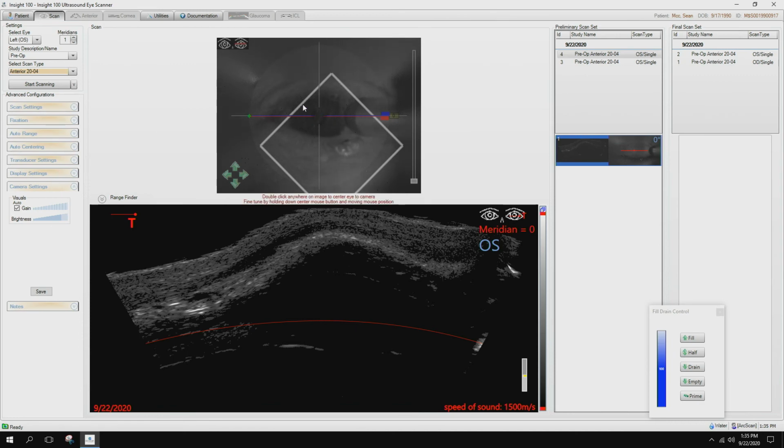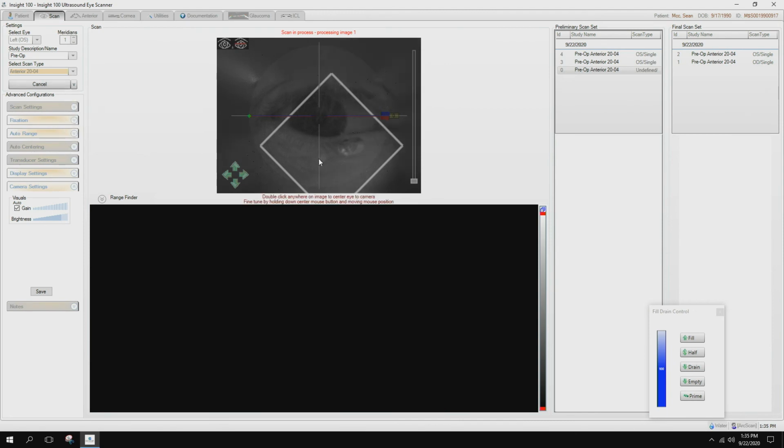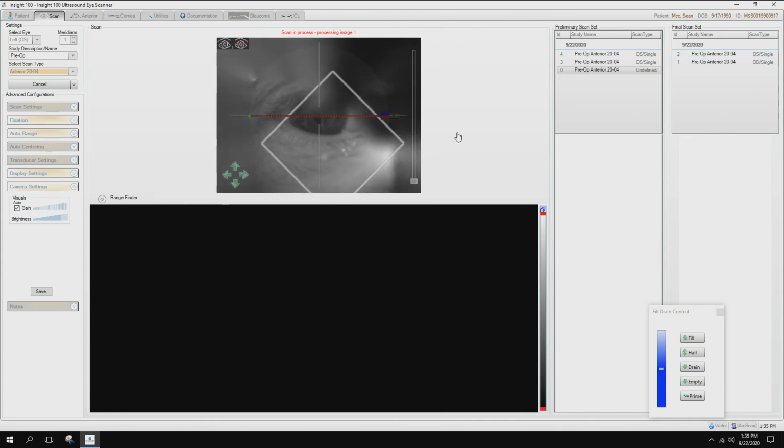and initiate your scan. I can still see bubbles on this patient's eyelashes. I can see their upper lid lashes are pushing down through. However, we're still fairly centered. We ought to be able to get a good image on this. It's a simple bicanthal plane. Let the instrument center, wide open, and there we have a good image right away.